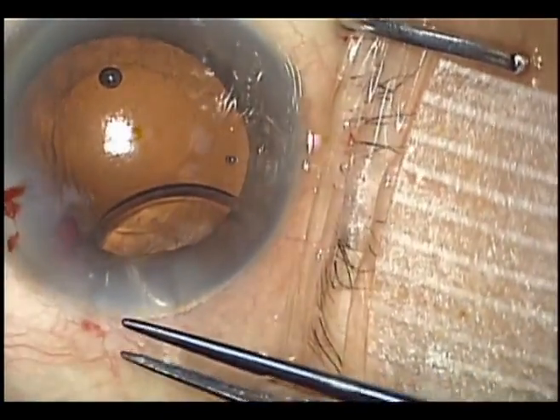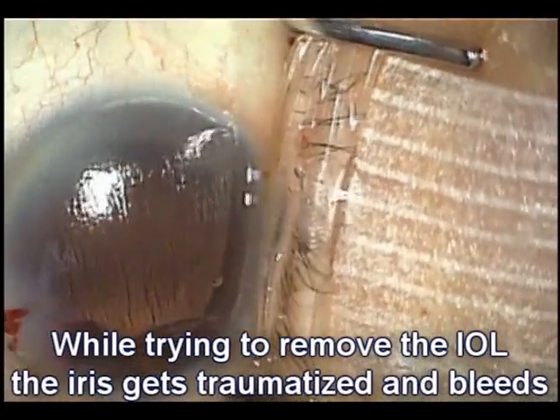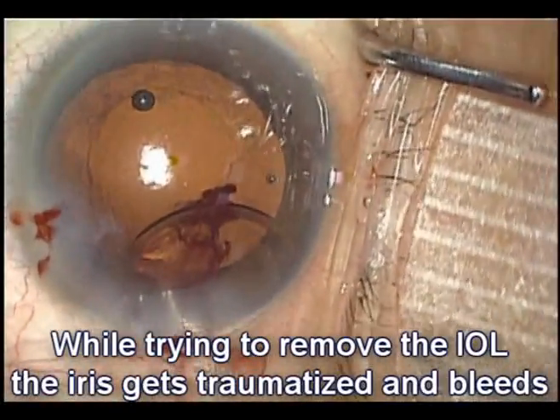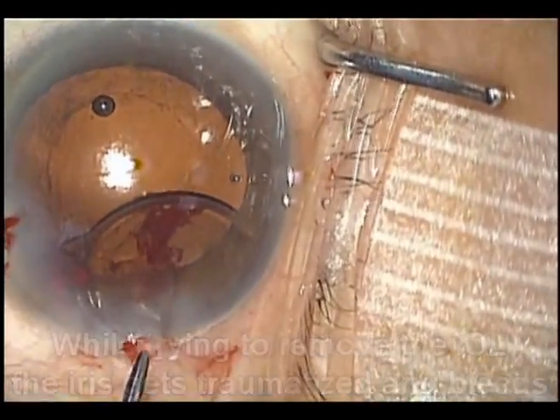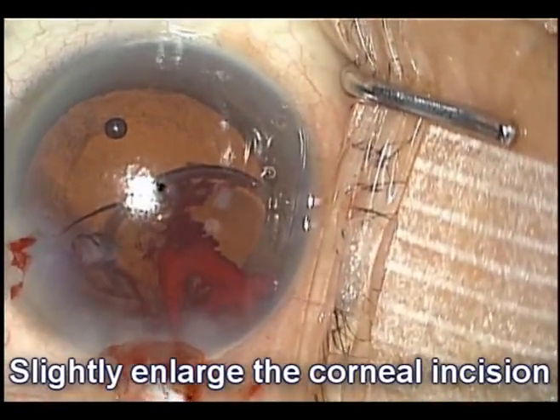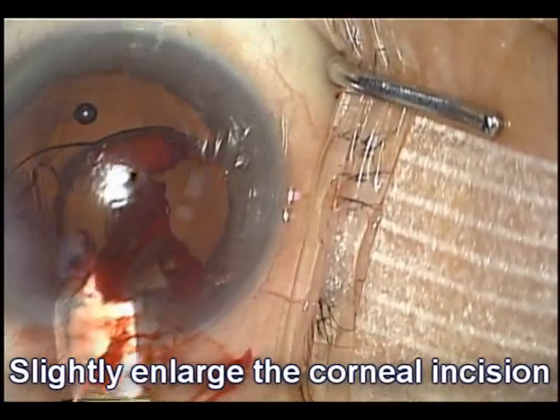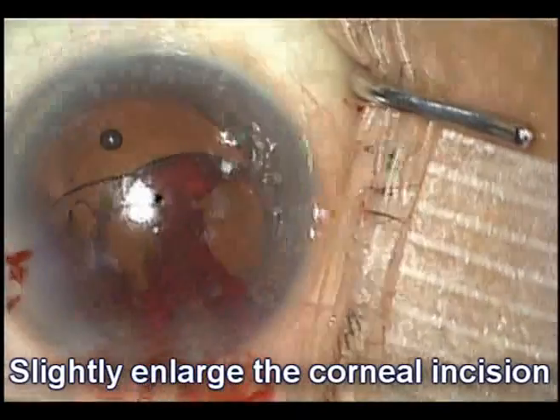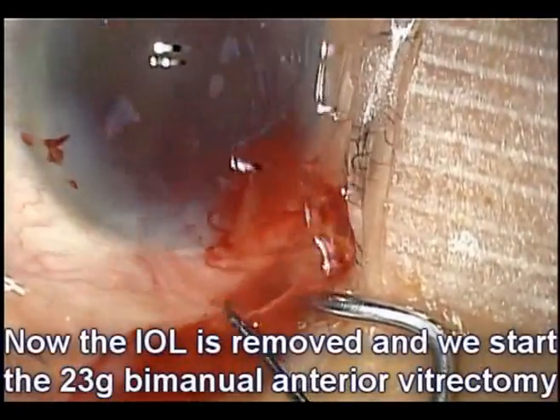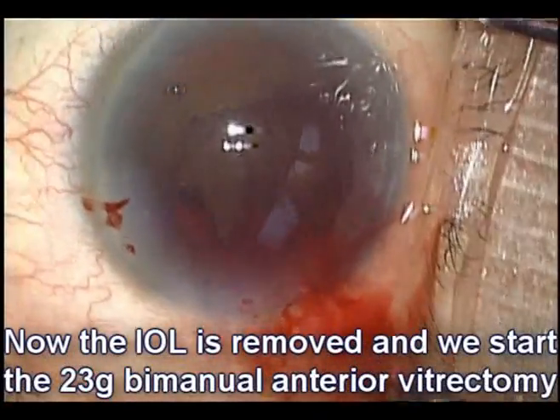We're going to remove the lens with forceps. As we're trying to remove the lens, it traumatizes the iris and we get some iris hemorrhage. Let's make life a little easier — we should give ourselves some room and slightly enlarge the incision. Here's the diamond knife being used to do just that. Much better to have a slightly enlarged incision. Now there's a lot more room, and we can remove the lens completely. Here's that offending lens in its entirety being removed from the eye.